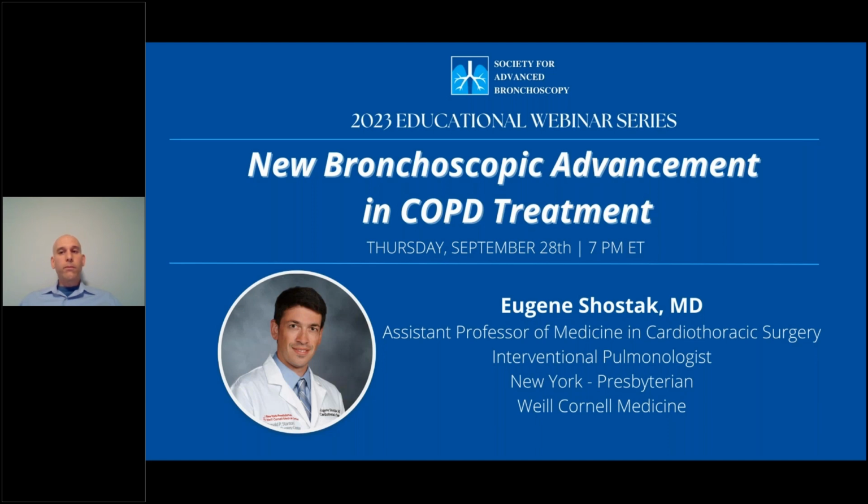Great. And that kind of leads into the next question. So how do you assess whether a fiducial has been placed accurately? Yeah, so that's something that we were talking about during the conversation, right? One is to say, okay, did the patient wake up from the anesthesia and there wasn't a pneumothorax? Okay, success, that looks great.